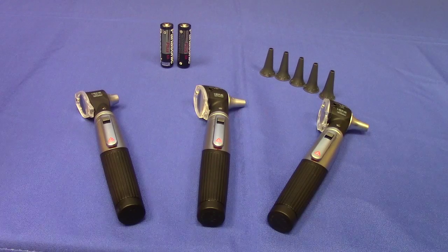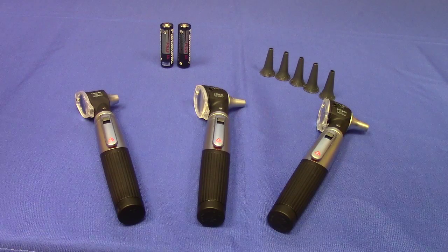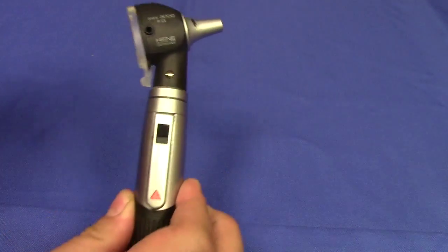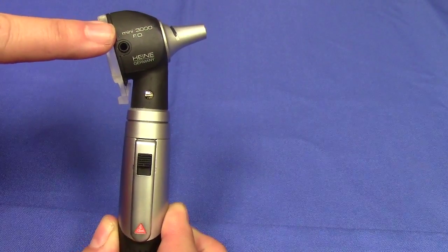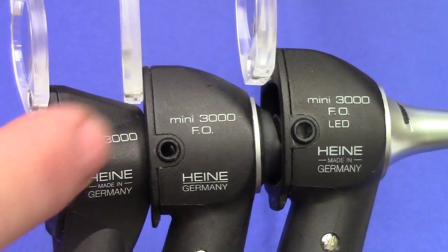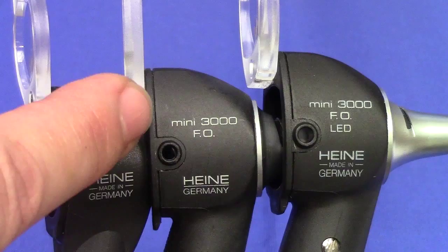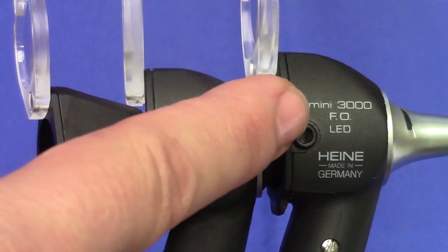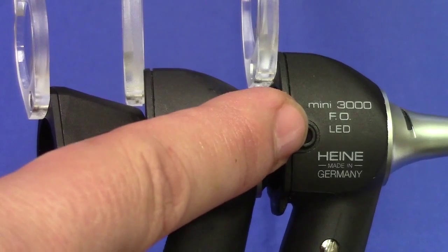The three models appear identical, and there is a really quick way to tell the difference between the three. First, locate the etching on the side of the otoscope head. The non-fiber optic will read Mini 3000, whereas the fiber optic model will read Mini 3000 FO, and the LED fiber optic will read Mini 3000 FO LED.